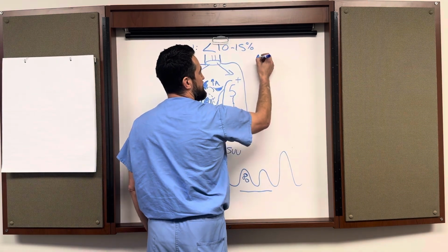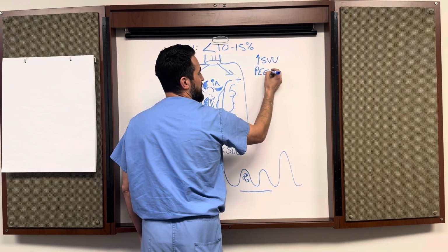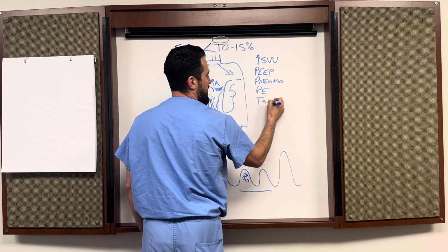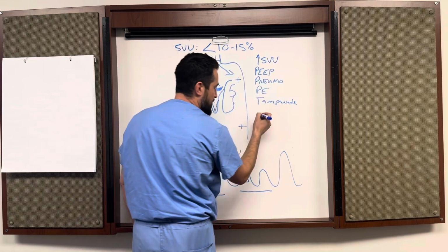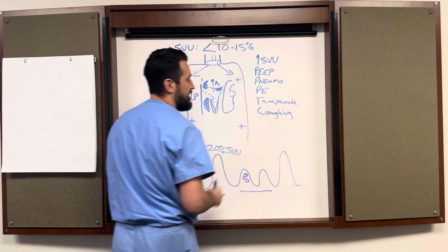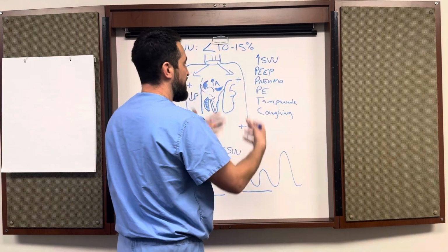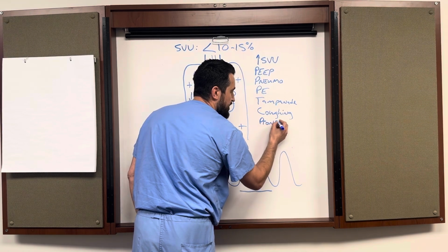So things that drive your SVV up that are not fluid are things like an increased PEEP, like a big pneumo, right? If you had PE, cardiac tamponade, right? These are all pretty big physiologic things, but the biggest one that we see is coughing. Coughing or fighting with the vent, those things really increase thoracic pressure. So just remember, anytime you increase your thoracic pressure, you are going to see more stroke volume variation. Like in the operating room, we look at prone cases just because of the compression of the thoracic cavity.